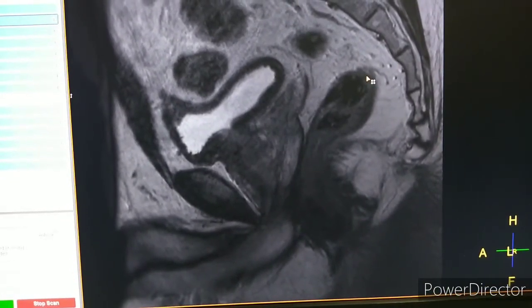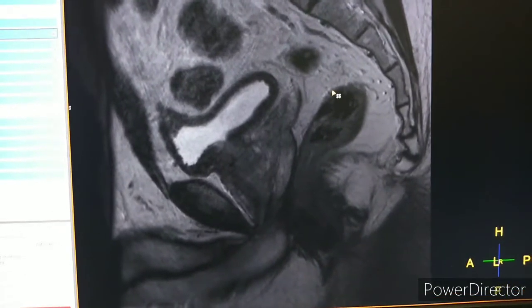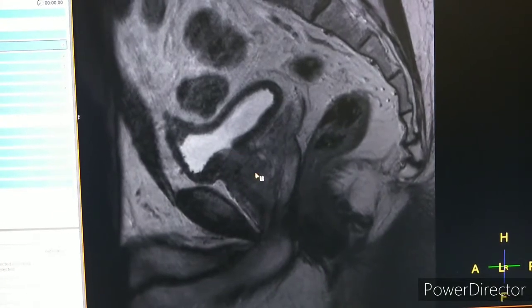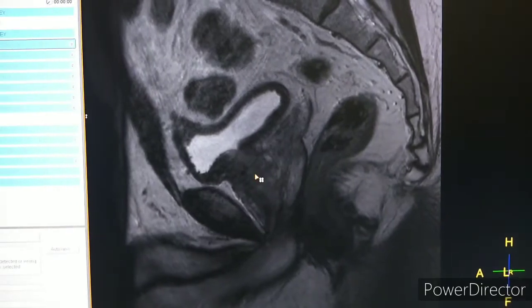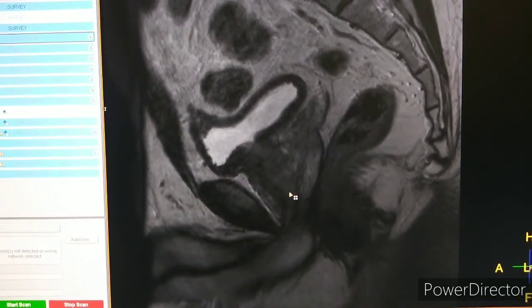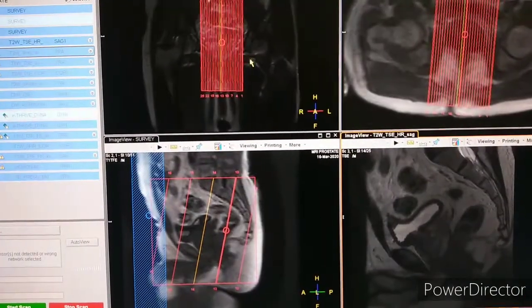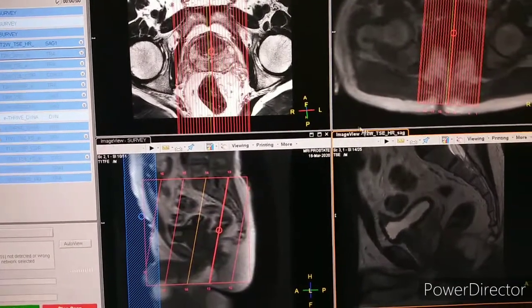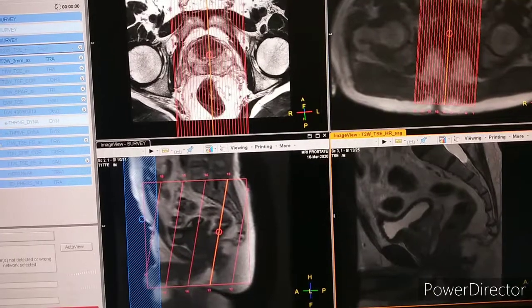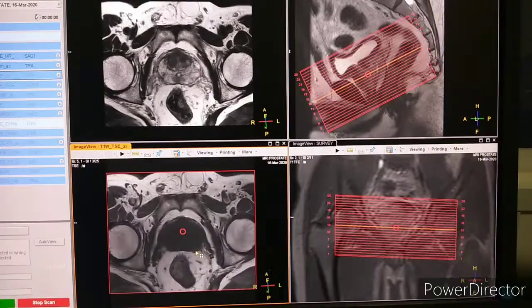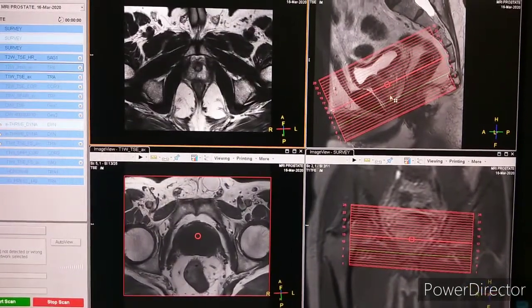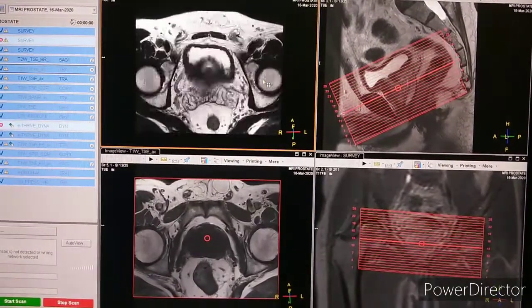Before planning further sequences like coronal or axial, we have to see the reference line. The reference we take is the urethra — this is the urethra. So the planning of axial and coronal should be perpendicular to the urethra. This is the reference line we will use.